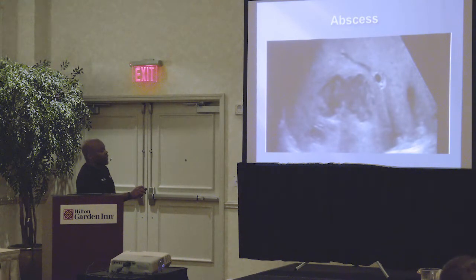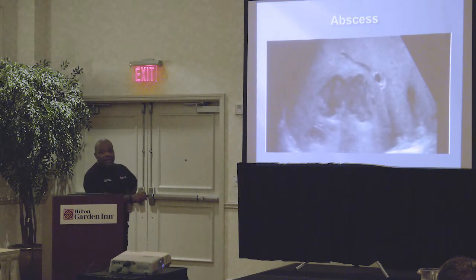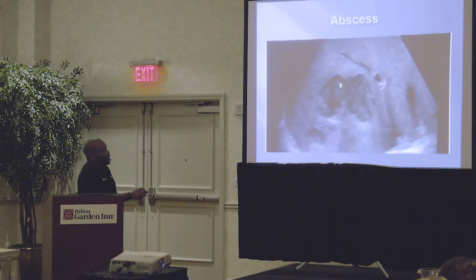You check your depth, of course, pick your needle size and go straight into the center of the abscess. I would probably give the patient a little lidocaine if I were you. And then you just drain out the abscess there and you can kind of see it go away. It's really, really cool.